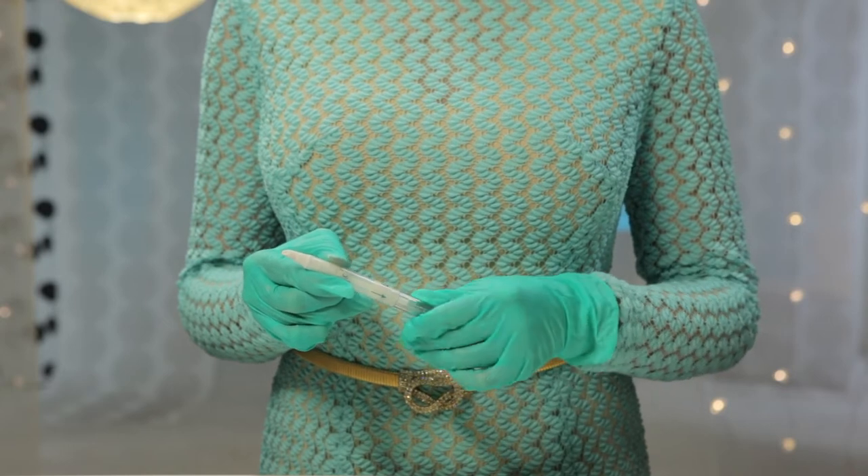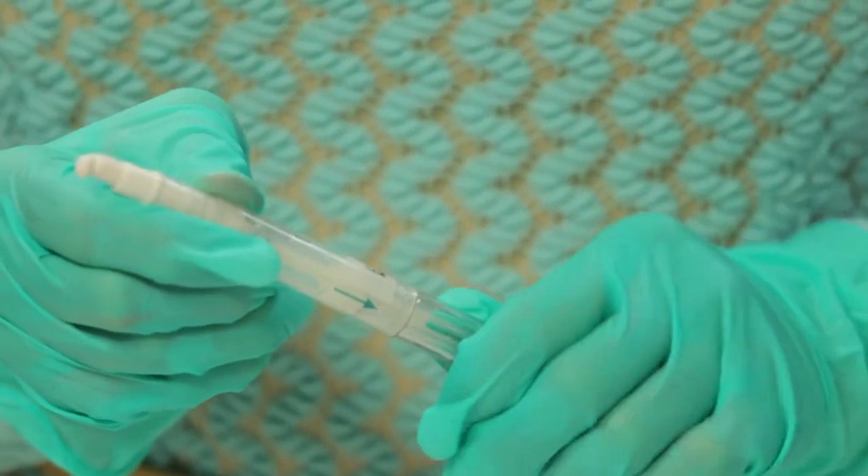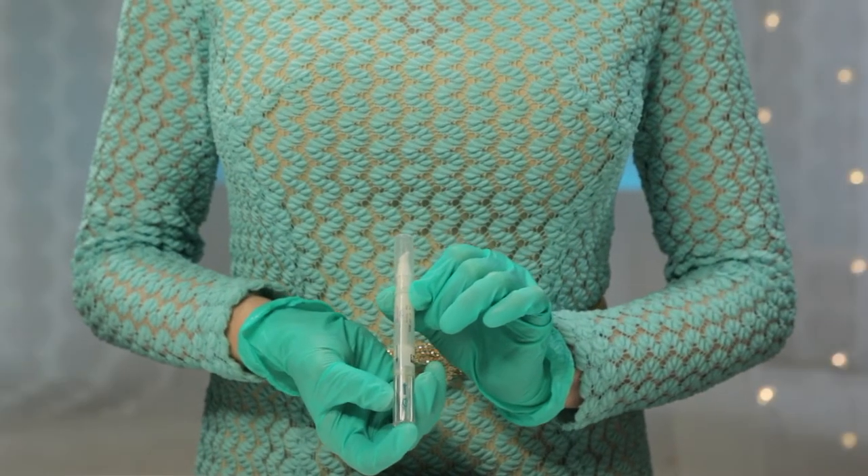Okay, let's prepare the dose. Starting with the two arrows aligned, twist the applicator the number of times your prescription calls for. This is usually one or two revolutions — it may be more, so be sure to check your prescription. By the way, revolution is just a fancy word for twist. Now the correct dose is ready to apply.